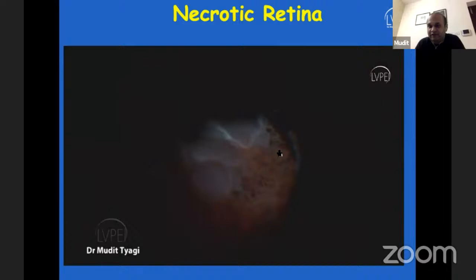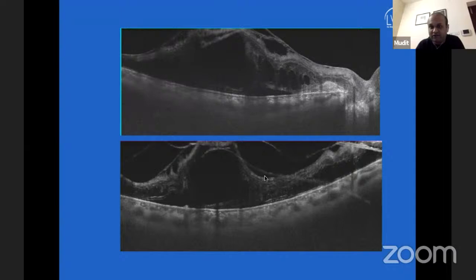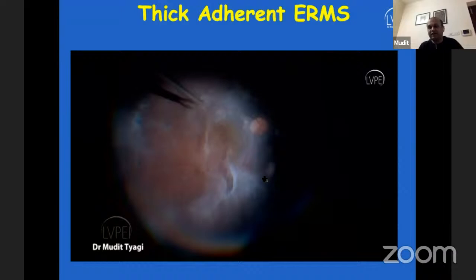The next point is ERM. That is another point in these detachments. In ARN eyes, you have got thick ERMs. And if you do not remove them meticulously, this is the pre-op OCT of one of our patients with ERM and all of this thick membrane over there. If you don't remove it carefully, that is one of the main reasons for recurrences in these eyes. This membrane is very thickly adherent to the retinal surface. Sometimes we might not even be able to perceive it. So now I have started staining my retina with ILM, with brilliant blue, to see if there's a thick membrane which I'm missing out upon.